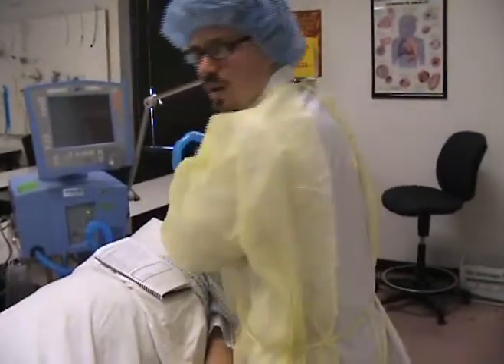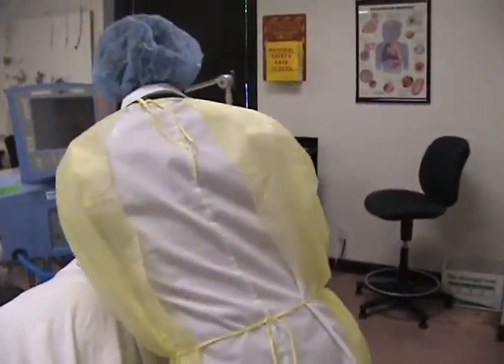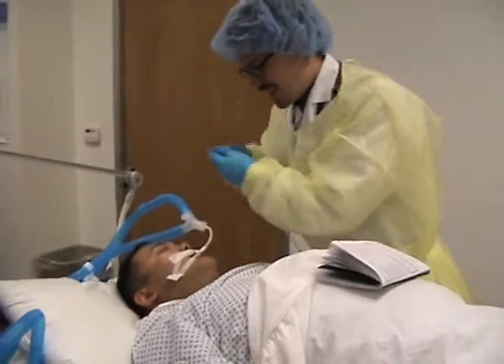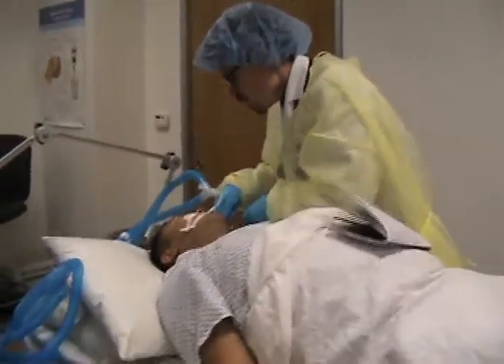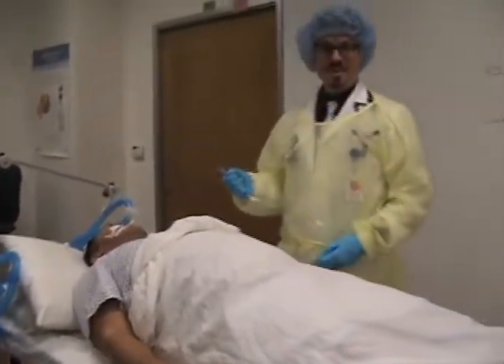Step five of our vent check is emptying the condensation from the patient. After you've emptied the condensation, you're going to go ahead and suction them — this is always a lot of fun.